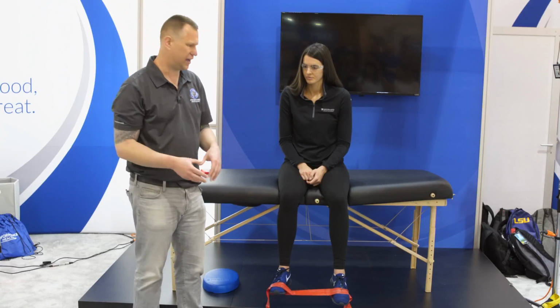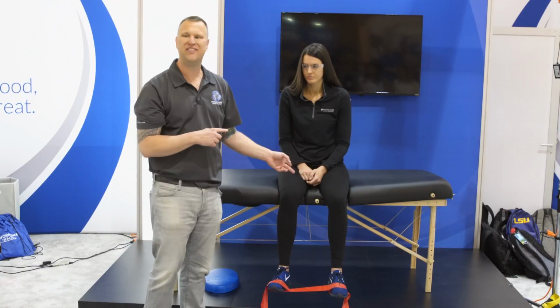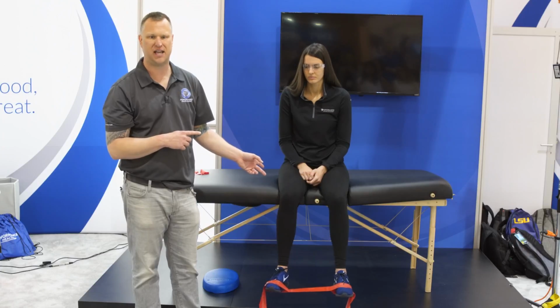Now, the ease of the CLX is the fact that look how easy that was to just slip on the foot, no knots and so forth. Could she then take that home as part of a home program? The answer is yes, very easily. Find a place to sit, edge of bed.